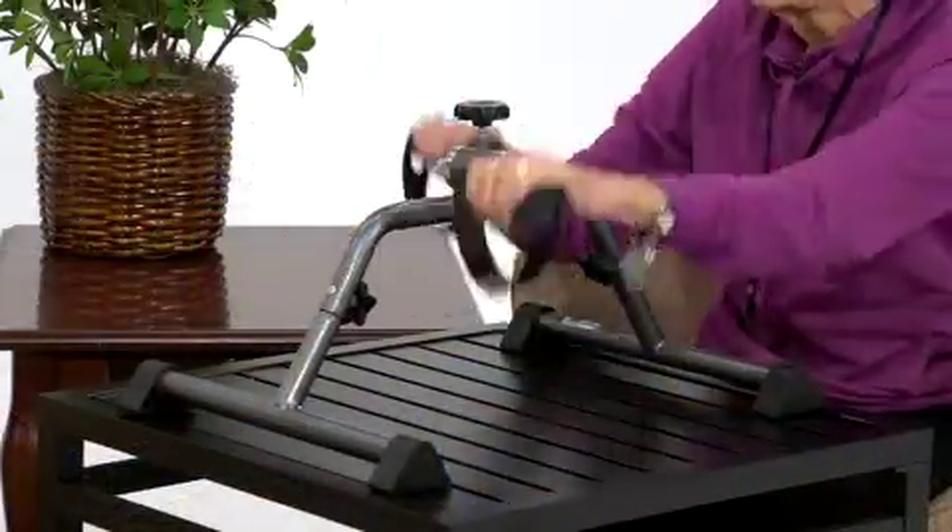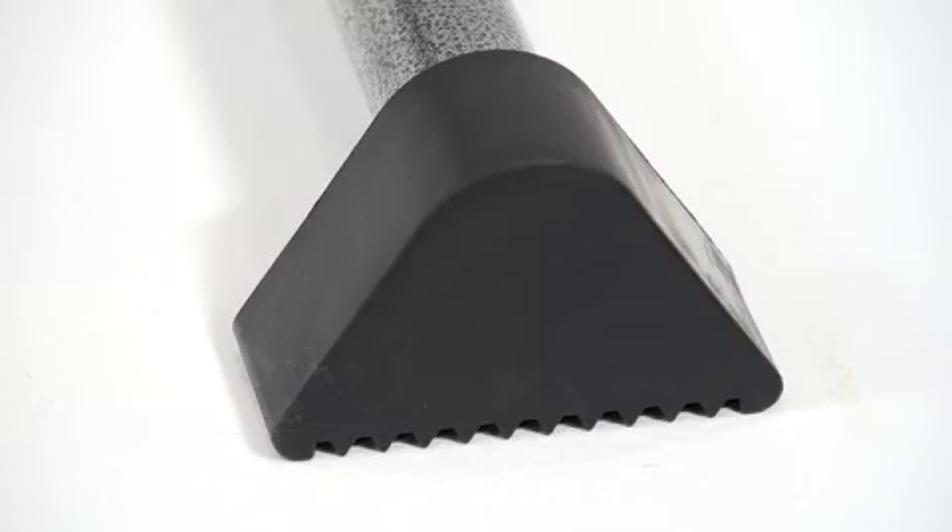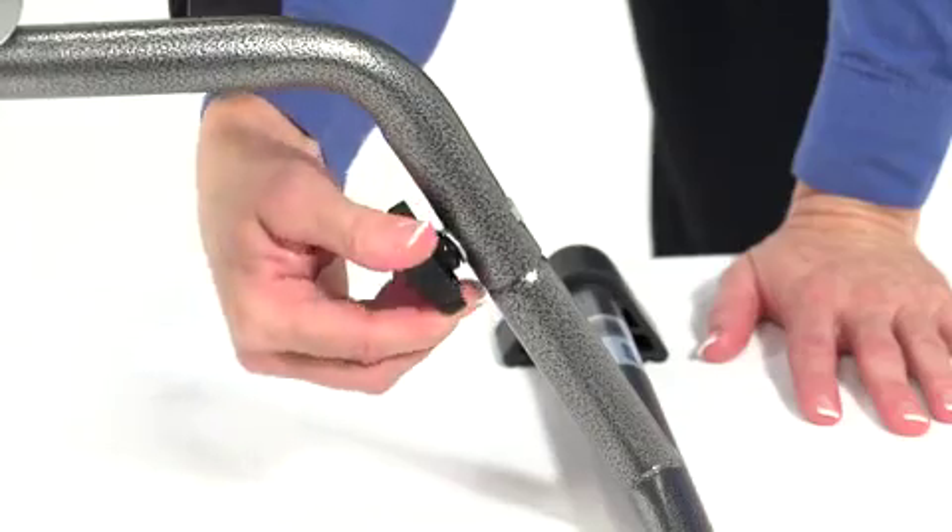Users can just sit and pedal from the comfort of their home, office, or anywhere, so there's no worrying about the weather or having to put on workout clothes. And these rubber anti-slip pads help protect floors and prevent sliding. This Exercise Peddler assembles without tools.